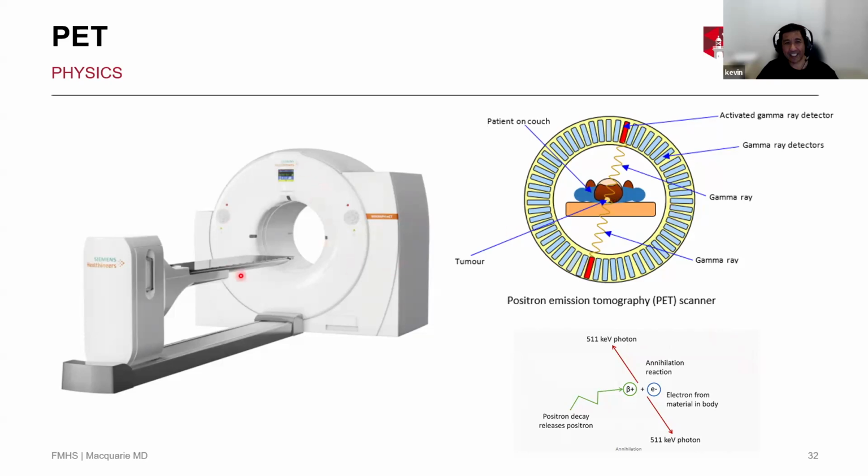So the CT scanner does two things. It allows correction for attenuation. So from the CT, you can work out the density and you can say, well, something that comes from further inside the patient should be boosted. We should increase the value of that, and anything coming from the skin, we're going to suppress that. And you get much better representation of the actual activity in the tissue, okay?